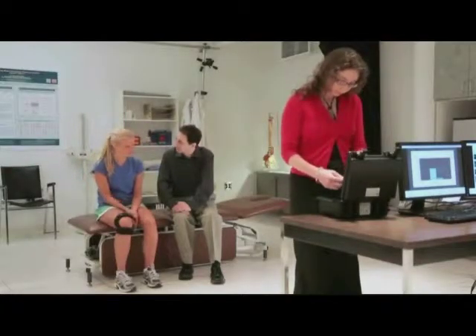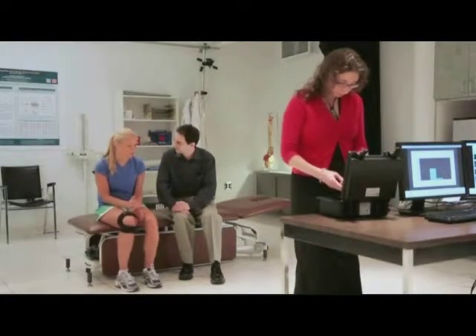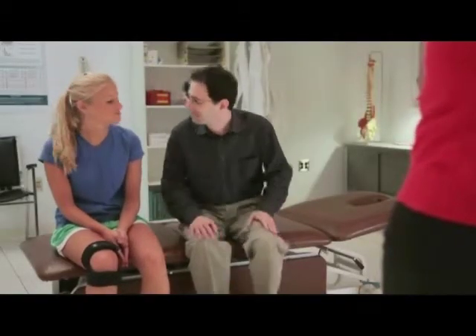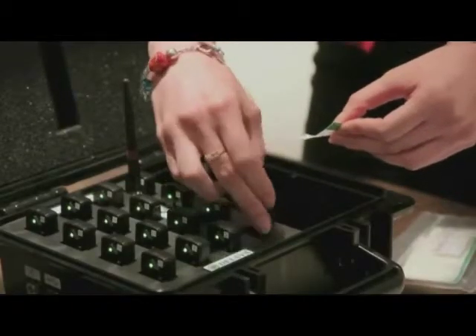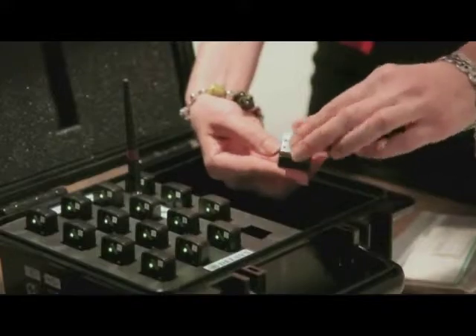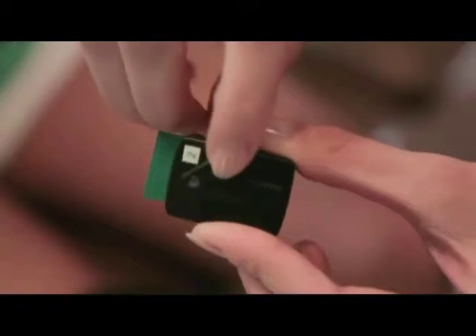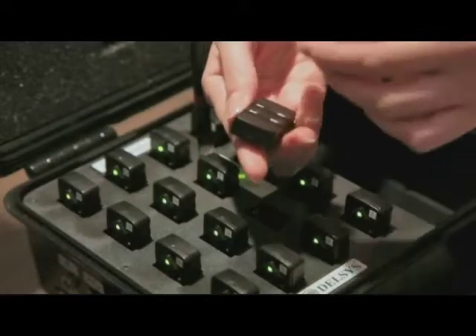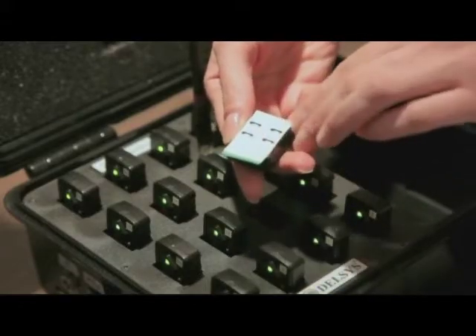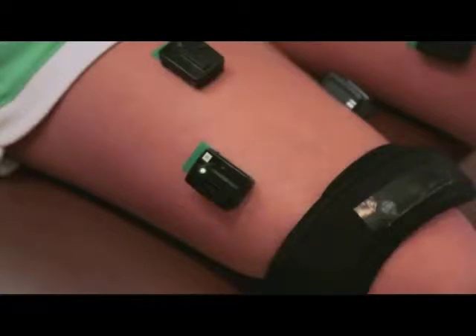They will use the new Trinio EMG system to follow Monica's recovery process. The Trinio EMG system offers the most accurate and comfortable way to measure muscle activity, detected by placing any of 16 miniature sensors over the muscle of interest, transmitting to a receiver up to 30 meters away. The sensors amplify and stabilize signals on location, minimizing noise and removing the need for encumbering cables. Each sensor is also equipped with a triaxial accelerometer that relays inertial information about the sensor's movement and orientation.